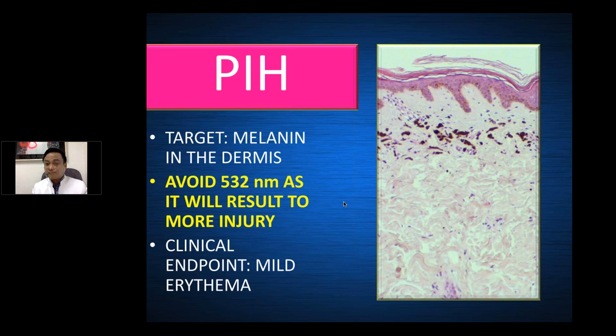And for the clinical endpoints, always mild erythema only. Avoid purpura. Avoid purpura or severe or very prominent erythema.